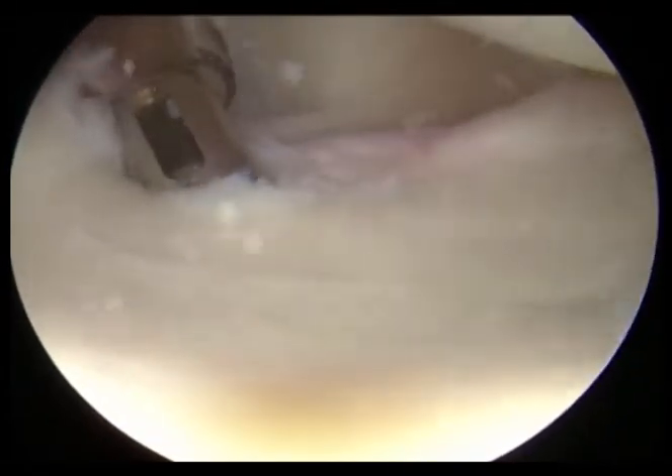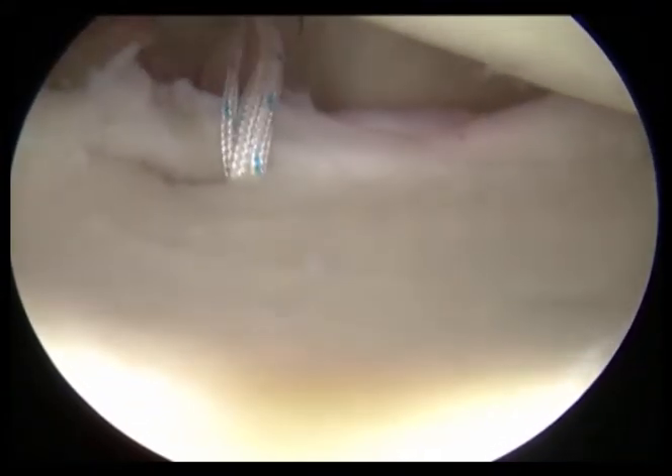Here we are impacting that small anchor into the bone. This is something you'll never see or feel — it's kind of like a filling in a tooth; it's just inside the bone.